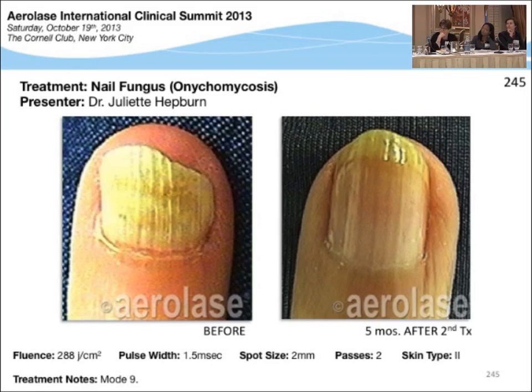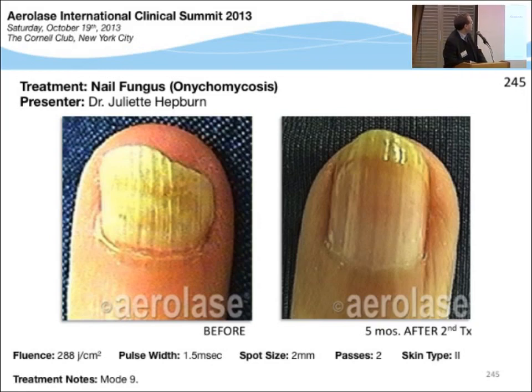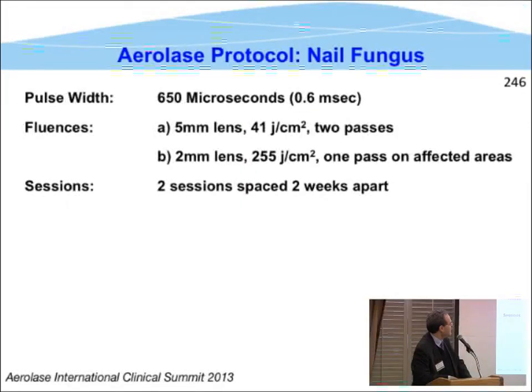Just to be my ornery self, I said this is the Aerolase protocol. I think it's a little rough. Is that the 5mm lens with two passes? I haven't seen a need for that. I'd just be concerned that you're producing too much heat in the area. I would probably try this after the initial protocol has failed. If you get a positive result, then I would go to this. But I certainly wouldn't start off with that. But again, that's just me.